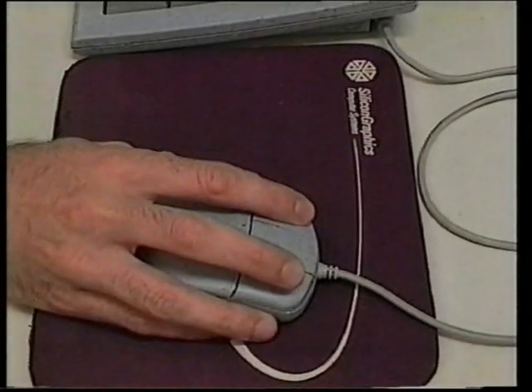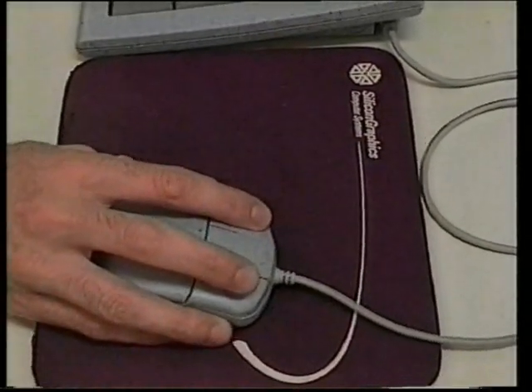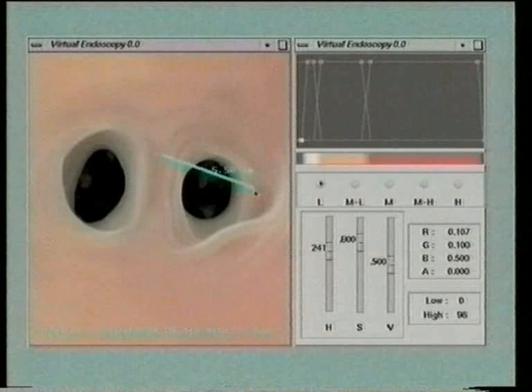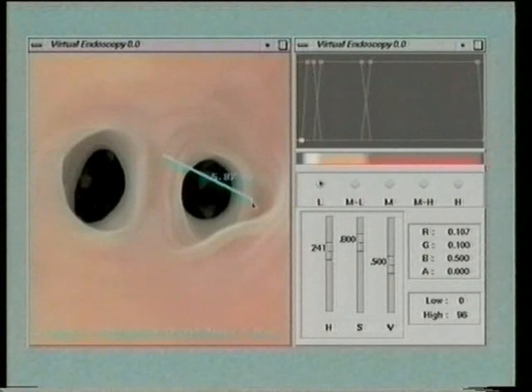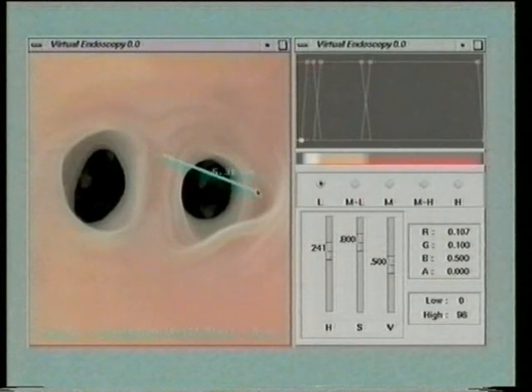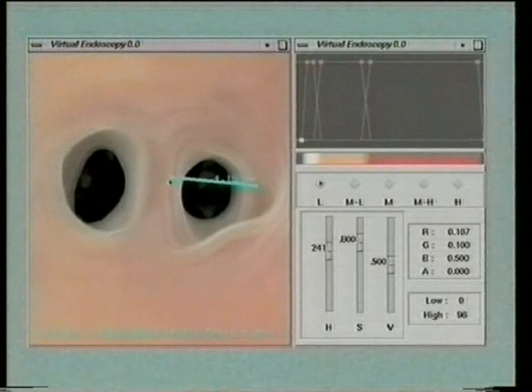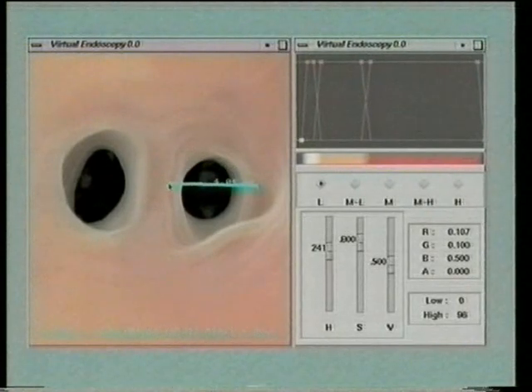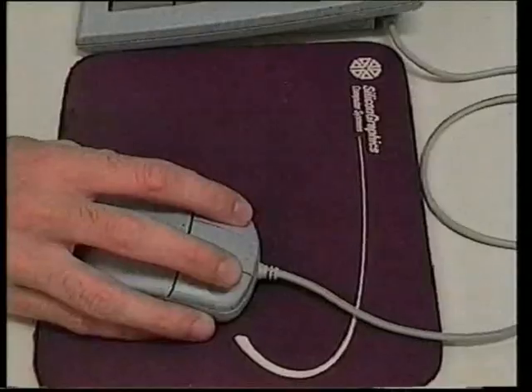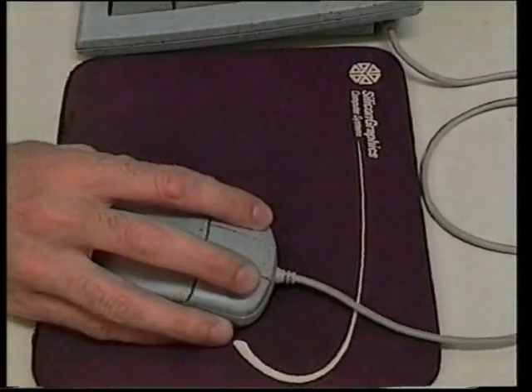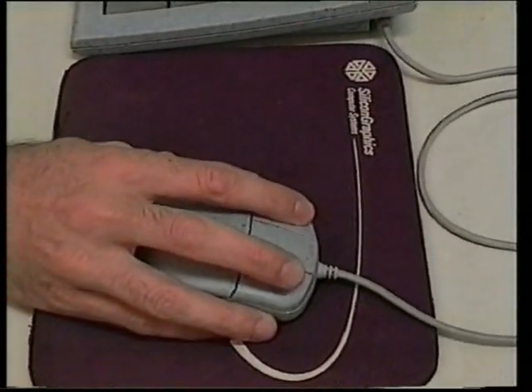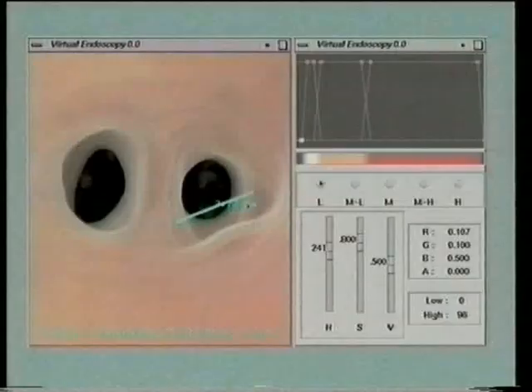Here, we measure the variation in lumen of the vessel by dragging a ruler whose endpoints automatically follow the interior vessel surface. Point picking with cursor following is implemented by casting rays from the 2D mouse position.